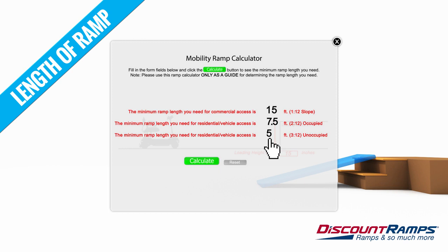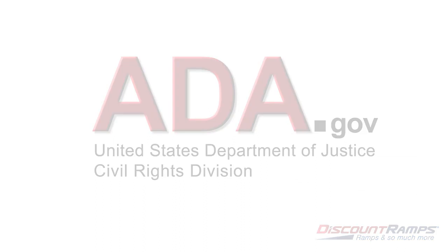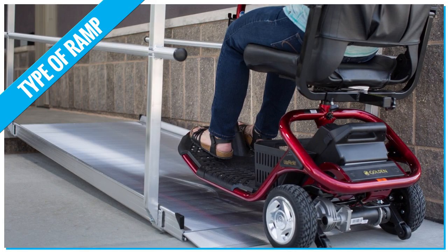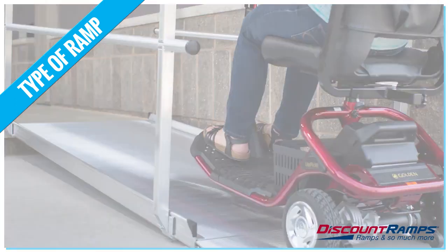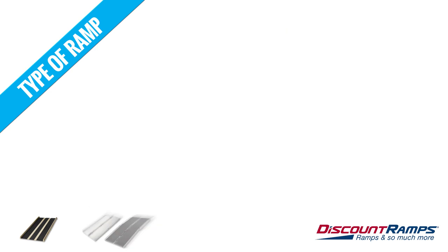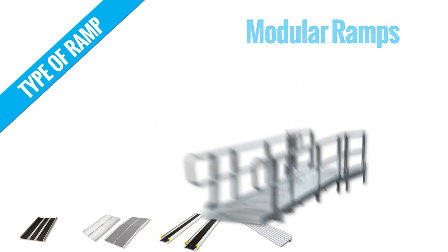These numbers follow the Americans with Disabilities Act guidelines. You can find out more about these guidelines at www.ada.gov. The next important question is, what type of ramp do I need? Mobility ramps are very diverse, allowing you to find a ramp for your specific needs. They come in 5 basic types: non-folding or solid ramps, folding ramps, track ramps, threshold ramps, and modular ramp systems.